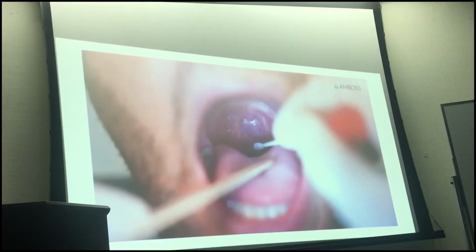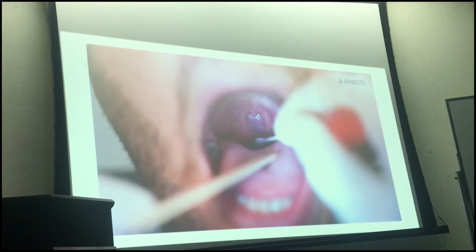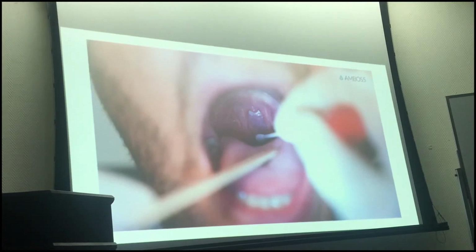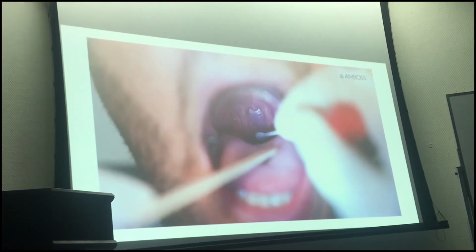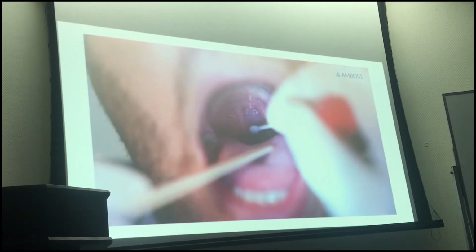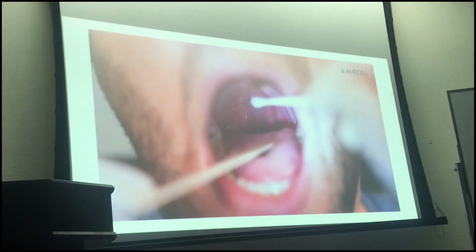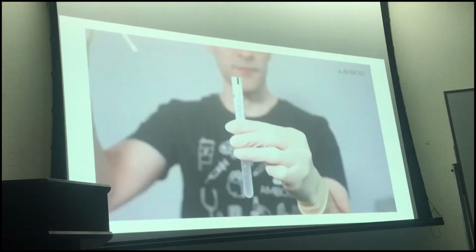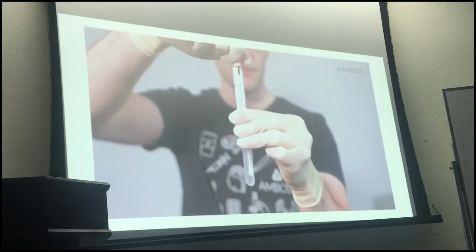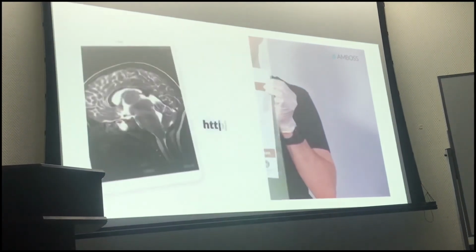Gently insert the swab into the oral cavity without touching the lips, teeth, tongue, hard palate, or soft palate. These surfaces should be avoided as they are often colonized by a wide range of microbes. Collect the sample from the back wall of the throat. Twist the swab shaft gently but thoroughly, sampling the oropharyngeal wall. Just as with the nasopharyngeal swab, the oropharyngeal swab should now be placed into the sample collection tube and sent to the laboratory as quickly as possible.